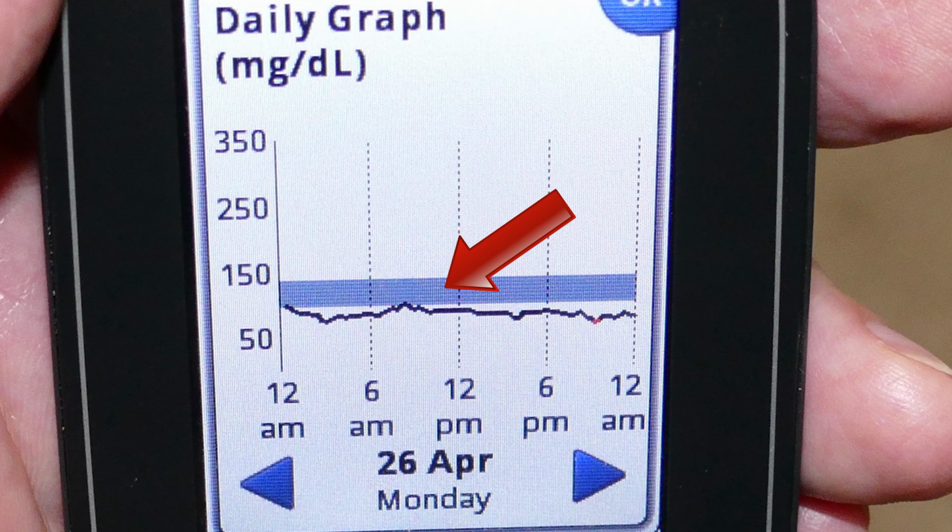And so as you look at the graph, you can see that I was below that practically the whole day. I barely seemed to touch the top of it, right around maybe 10 a.m. And then it started going down, down, down, and stayed low throughout the day, and actually got fairly low toward the evening and by the 12 midnight time.